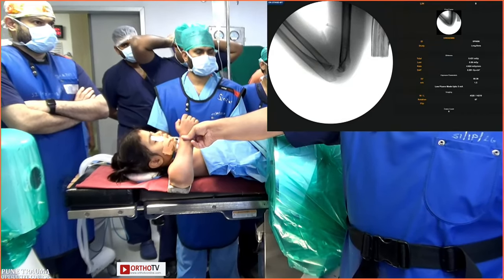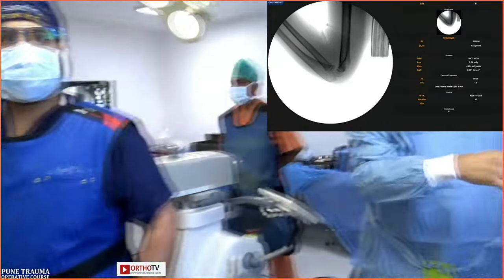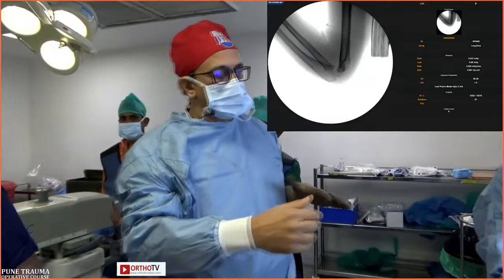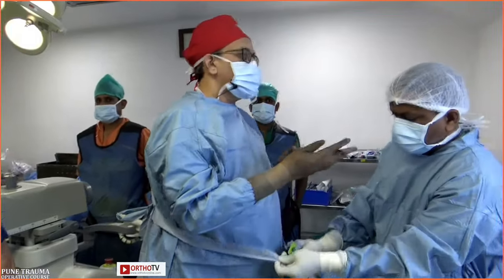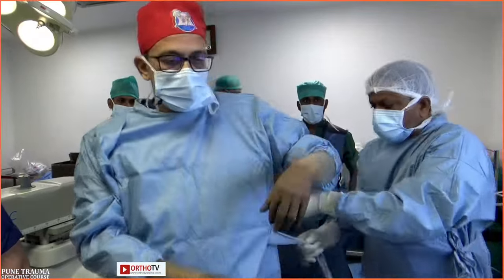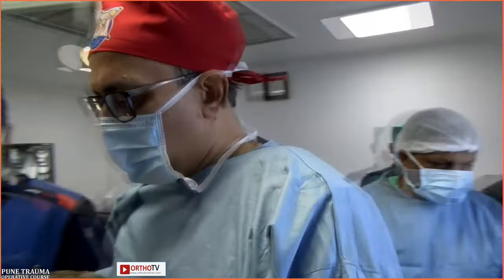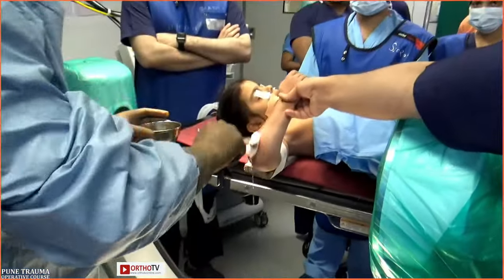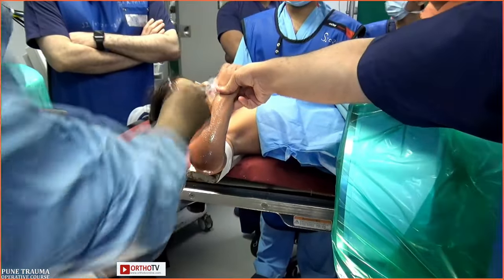So I'll just show you. A lot of things have been said about preparation. More and more literature and papers are coming about something called the semi-sterile technique. You don't need full preparation like you're doing an open surgery for pinning lower end radius or supracondylar fractures, with no difference in the infection rates. We've been following this for a long time. This is my skin prep all around. Vivek, can you wear gloves?